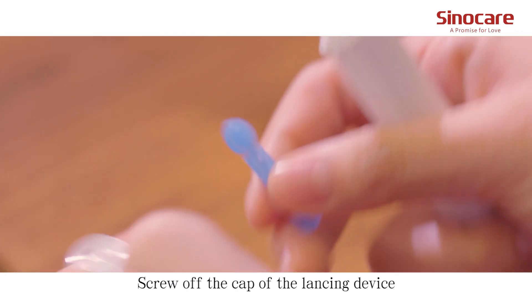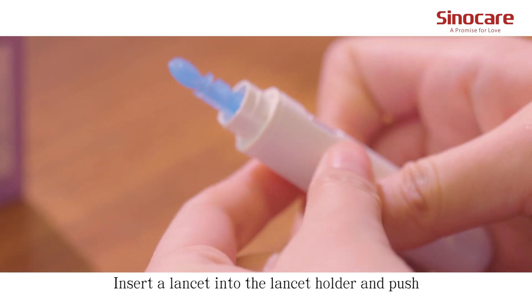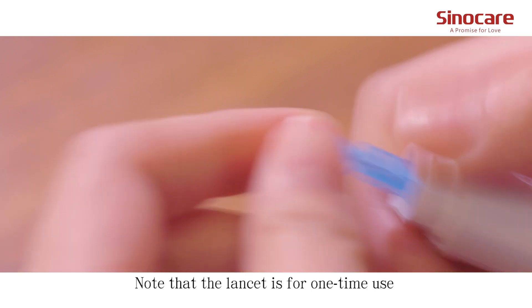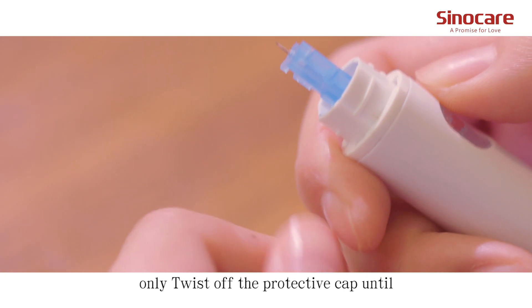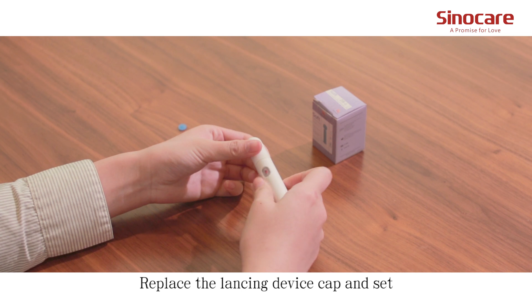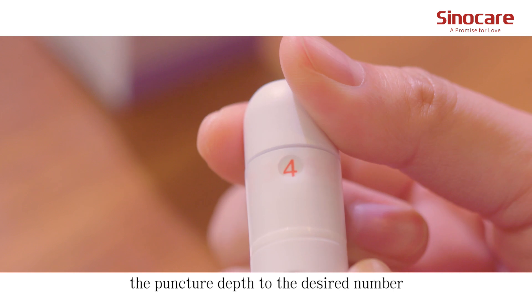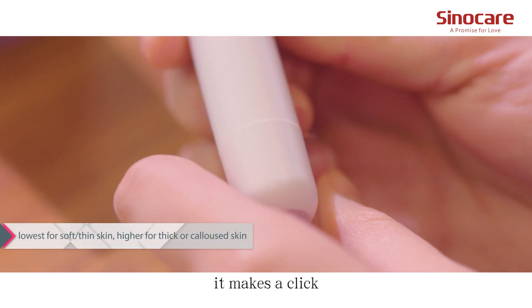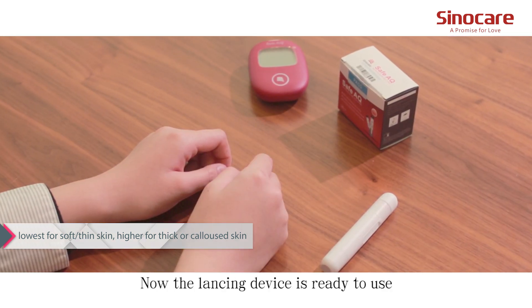Screw off the cap of the lancing device. Insert a lancet into the lancet holder and push down until it's fully set. Note that the lancet is for one-time use only — twist off the protective cap until it separates from the lancet. Replace the lancing device cap and set the puncture depth to the desired number. Pull back the cocking control until it makes a click, then release. Now the lancing device is ready to use.